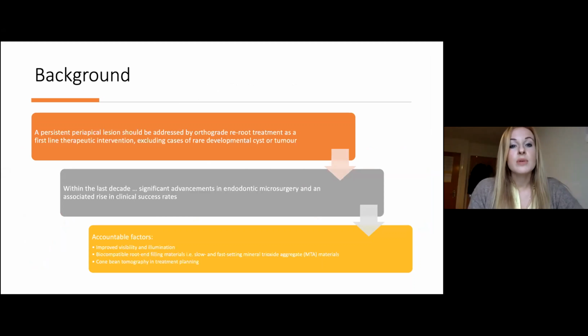There are some cases, such as rare developmental cysts or tumours, where a surgical approach is indicated sooner. Within the last decade, there have been many advances in endodontic microsurgery, which have been helped particularly by the improvement in instruments and materials that we have available to use in the clinic.